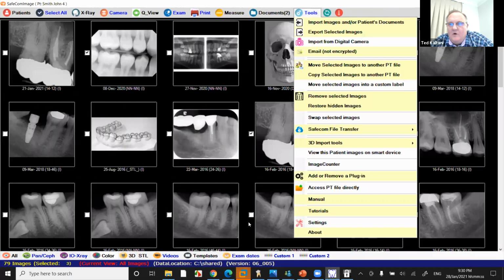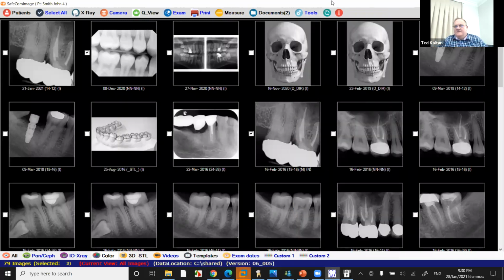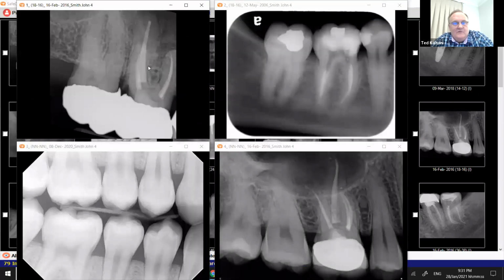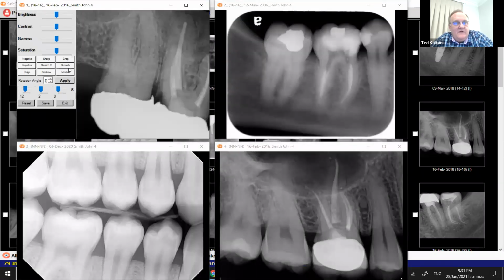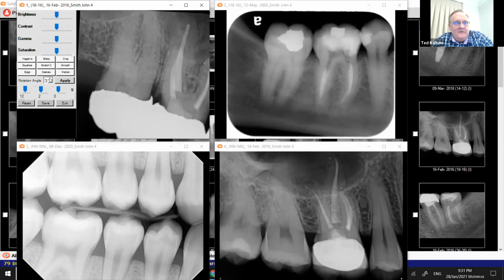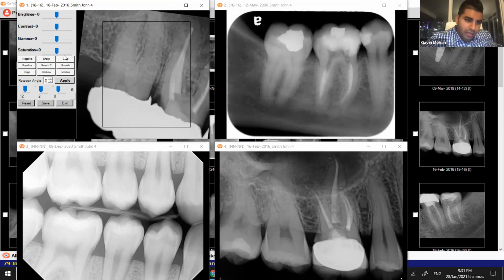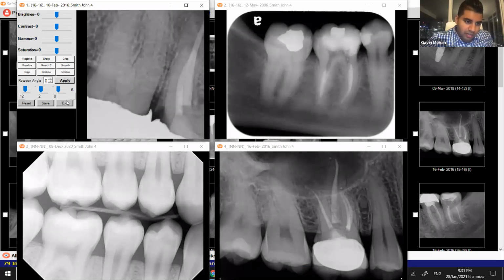As I said, if we can go over features, I don't think there's a point going into a lot of features unless you want to spend another 2 hours with it. But the features are day-to-day features: how to import images, how to bring things in and out of the program, how to capture, how to diagnose, how to view them side by side. And tools that you can use, like ortho stuff such as rotating images, cropping images, adjusting, and entering filters.